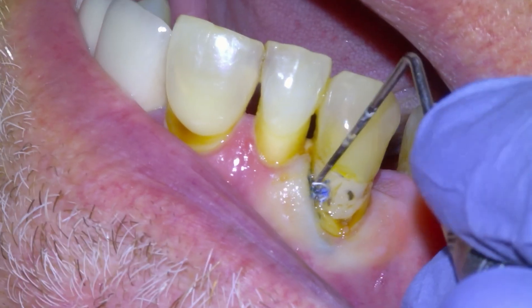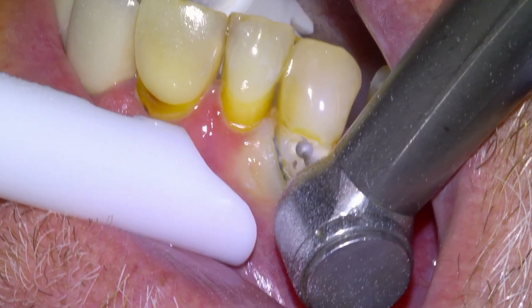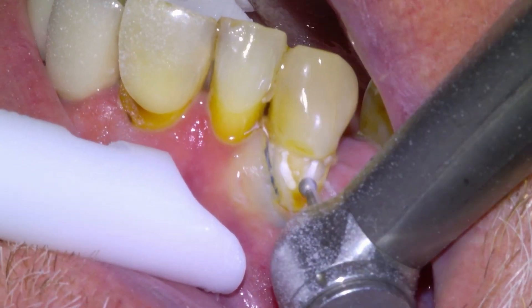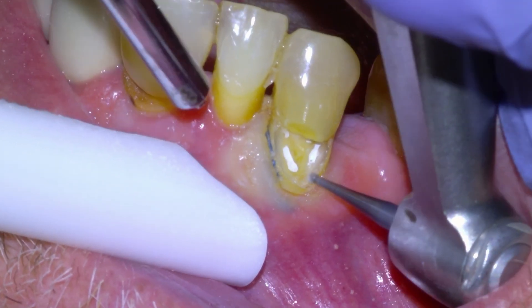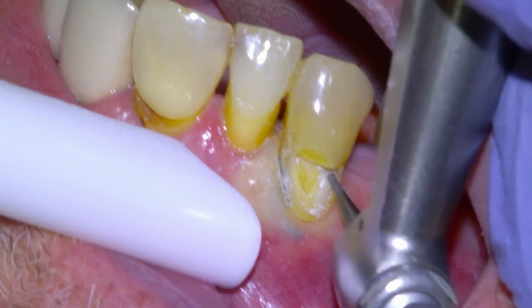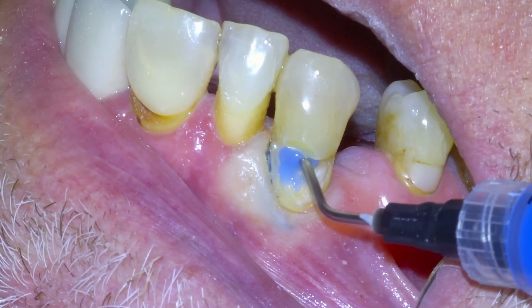Once we have some access to the margin, we're going to begin removing the old composite with a high-speed round diamond, removing the composite until we're mostly down to the natural tooth surface. Then we're going to remove the tooth decay with a slow-speed carbide burr and also remove any old restorative material with our slow-speed handpiece. The prep is pretty much complete and we're going to make sure that we can see our margin.